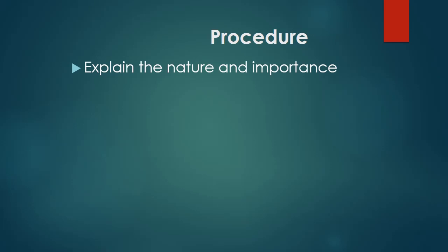So it's very important for you the nurse to explain to the understanding of the patient the nature of the procedure you are coming to perform, why you are going to do it, and then ways by which they can assist you to undertake this procedure.